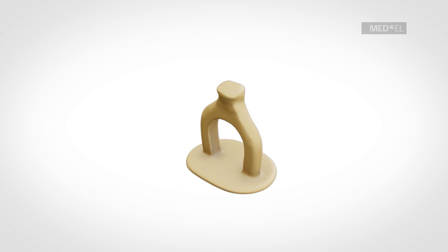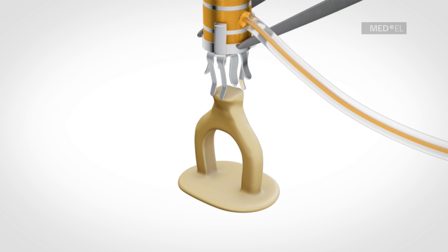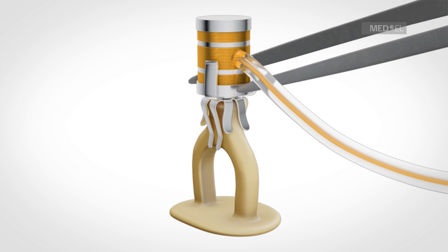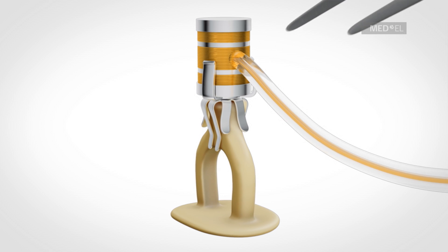The vibroplasty clip coupler is for placement on the head of the stapes. The orientation of the legs must be observed. The shorter legs are placed over the crura and the longer legs parallel to the stapes.